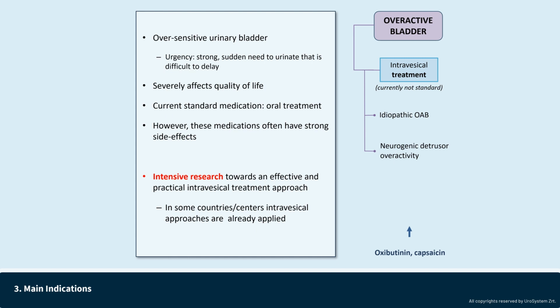The main limitation, however, of intravesical treatment currently is the need of repeated, regular, long-term administrations by medical personnel. Nevertheless, intravesical instillations are already being used successfully in clinical practice for overactive bladder in some countries and in some centers. And if patients can learn to apply intravesical self-treatment with the use of UroDapter, this approach could become widespread in the future.